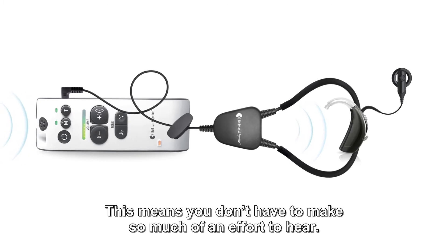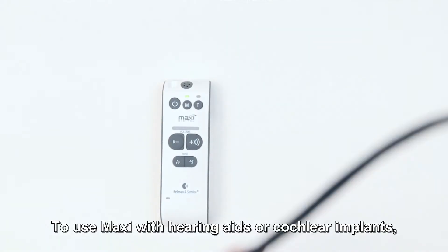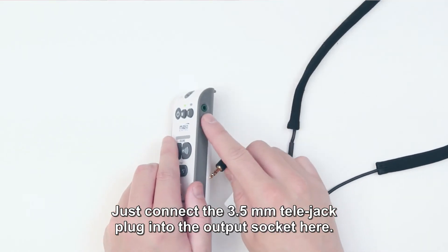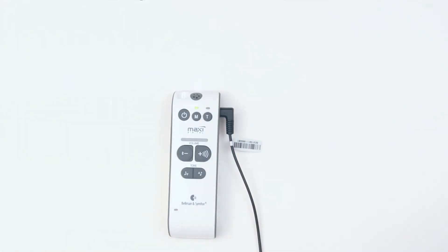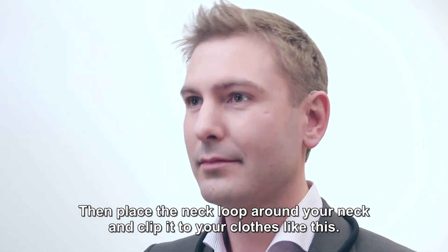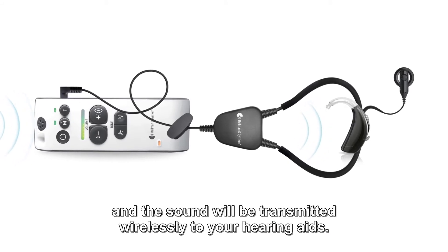This means you don't have to make so much of an effort to hear. To use Maxi with hearing aids or cochlear implants, you will need a neck loop. Just connect the 3.5mm tele-jack plug into the output socket here. Then place the neck loop around your neck and clip it to your clothes like this. Now switch your hearing aids to T-mode and the sound will be transmitted wirelessly to your hearing aids.